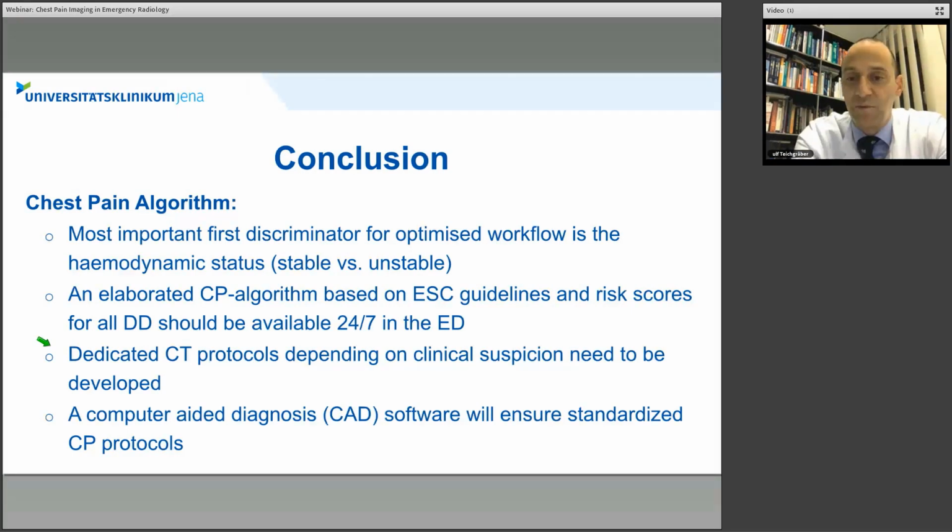Another question, do you perform one phase scan to minimize dose, or I don't get the rest of the question. One phase scan? Yes, well, that depends. One phase scan, yes, for those who are only getting the coronary, so our dedicated coronary angiography program, yes, we go for one phase only, also to minimize dose. For triple rule out, we go for all patients for a multi-phase program.